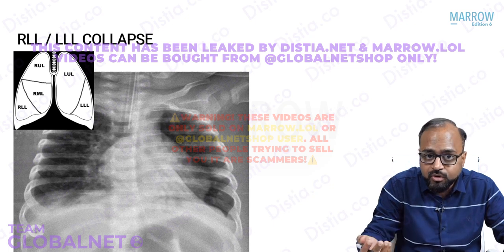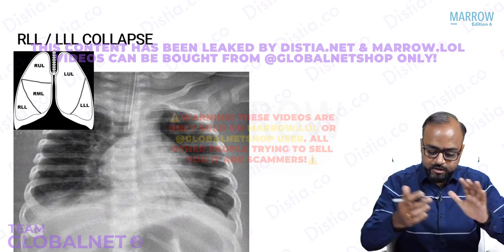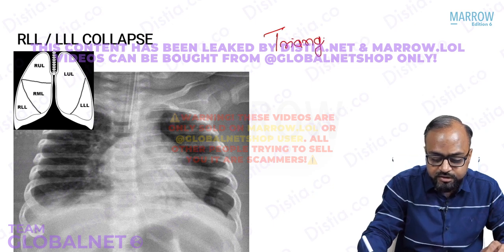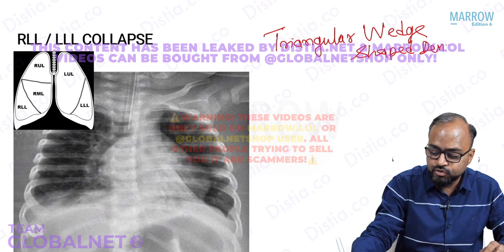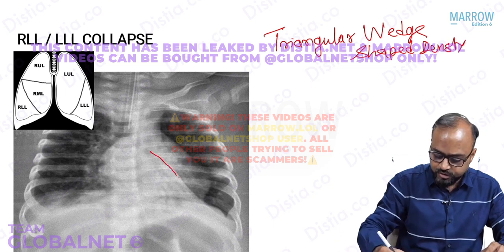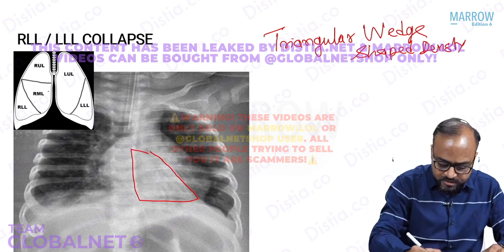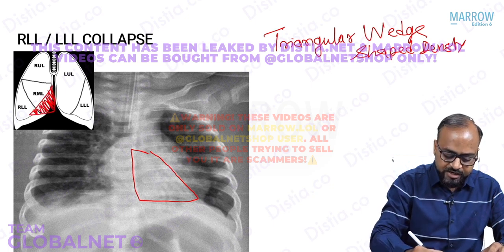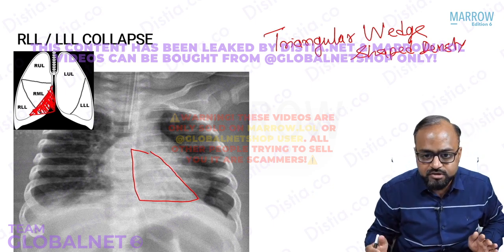Now, how does a lower lobe collapse? Whether right lower lobe or left lower lobe collapses, the collapse pattern is more or less similar. It creates a triangular wedge shaped density. So where is the wedge shaped density here? See, can you see a triangular wedge shaped density overlapping over the heart there? If the right lower lobe collapses, it will also create a triangular wedge shaped opacity, but on the right side like this. So whether right or left lower lobe collapses, they create a triangular wedge shaped opacity.